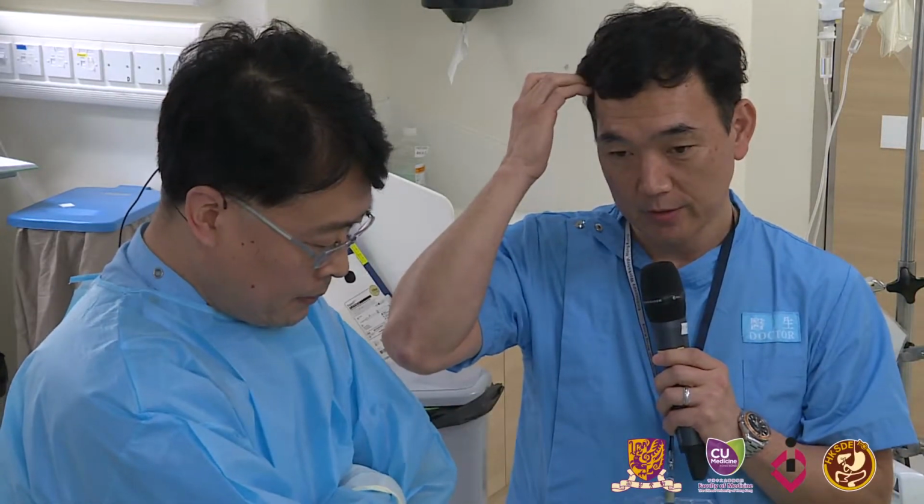I have no experience of the Overstitch. How about you? Do you use it for a lesion like this? The main issue is, as he described already, that the location in the fundus is very, very difficult to access. My colleague Stavros in New York did Overstitch in the fundus, but he had to make a loop going to the antrum and coming back all the way to the fundus to reach there, which can be really challenging. I think Overstitch wouldn't be really useful for fundus perforation.